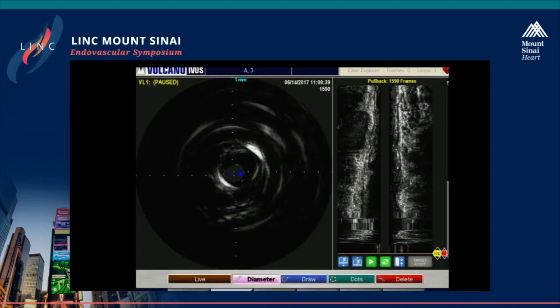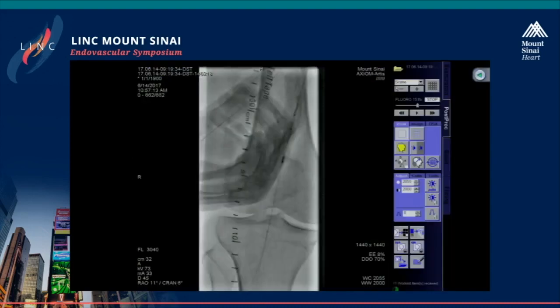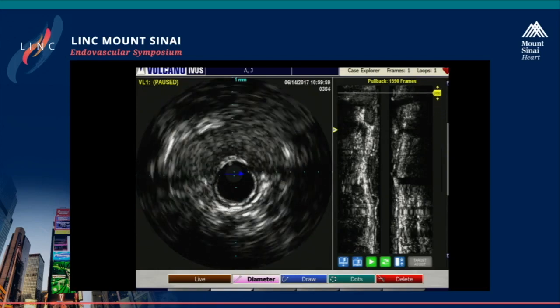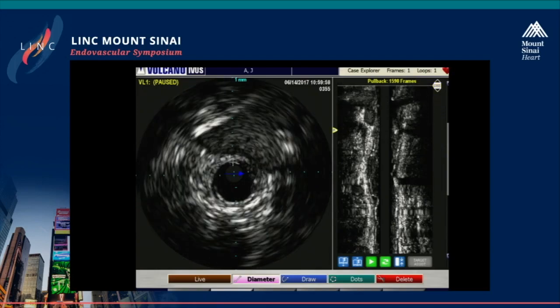So PK, I think this is great. Now you have a three-dimensional view rather than a two-dimensional angiogram. You know exactly what type of plaque morphology you have. You can personalize your care and prep the vessel adequately. In my opinion, if it were me, I'd probably use laser atherectomy because it's a homogeneous, heterogeneous type of plaque morphology, to try to decrease my risk of throwing any emboli and adequately prep the vessel.